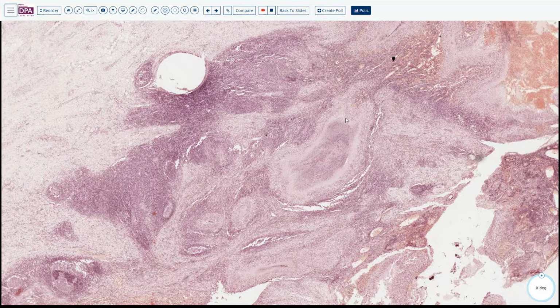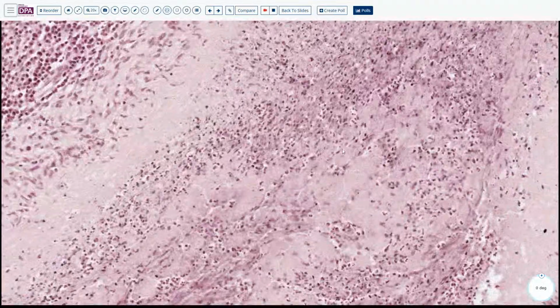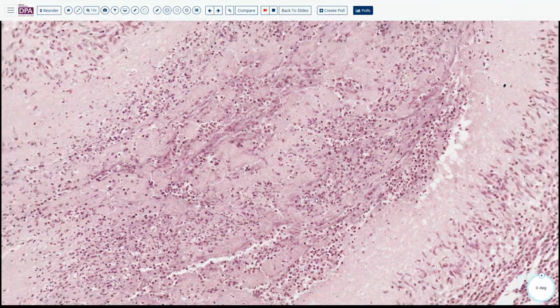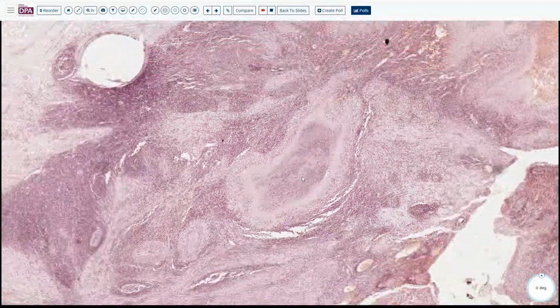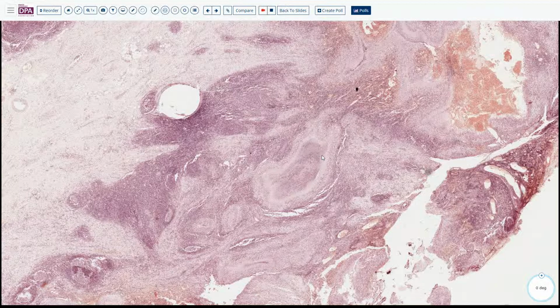And then we also have this really nice granuloma with necrosis in the middle, and then we would like to see some neutrophils and necrosis. So this is LGV. When you see a lymph node with this necrotizing granuloma, in a different clinical scenario, you just think about cat scratch, and then Yersinia, and then also the LGV.